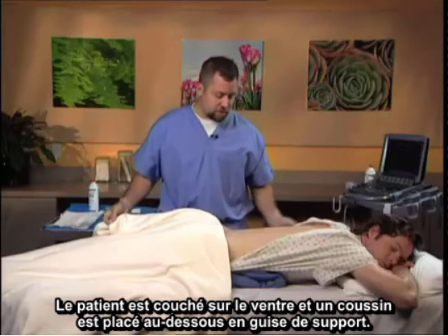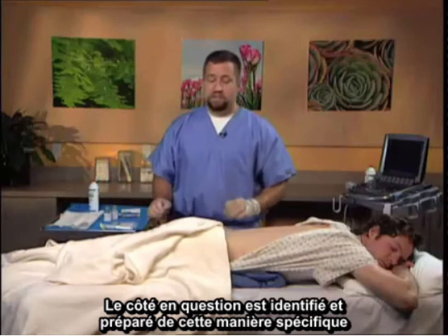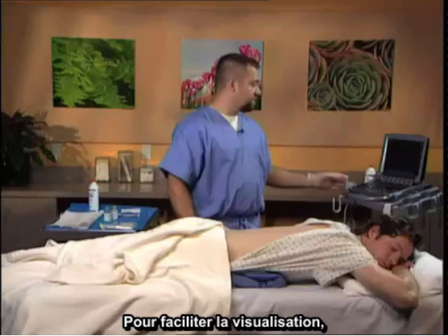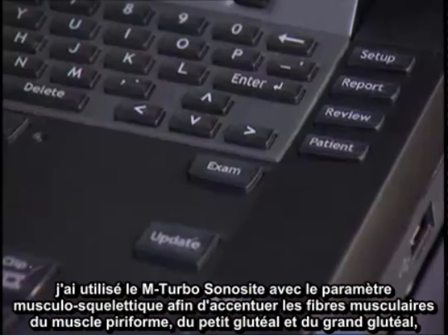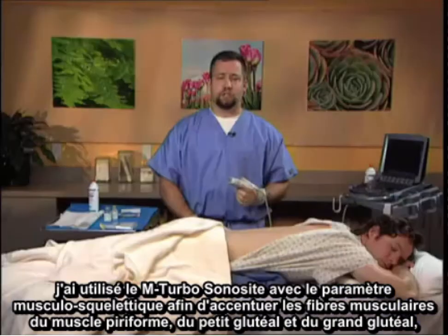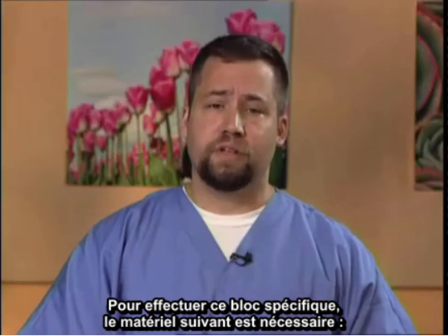The patient is placed in the prone position with a pillow underneath to provide a bolster. The side in question is identified and prepped. The gluteus is exposed. For facilitation of visualization, I utilize the SonoSite M-Turbo with the musculoskeletal setting to help enhance the muscular fibers of the piriformis muscle, the gluteus minimus and maximus, and the curvilinear shape facilitates entry of the needle into the targeted site.